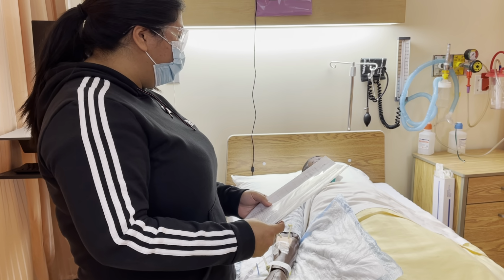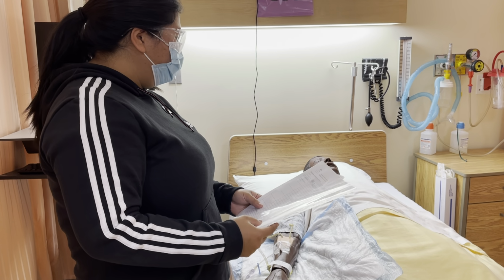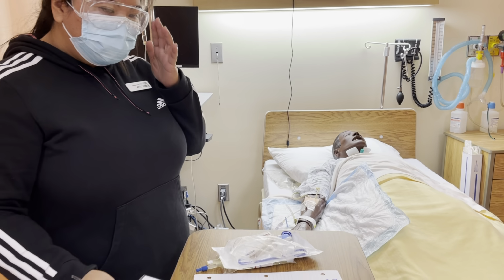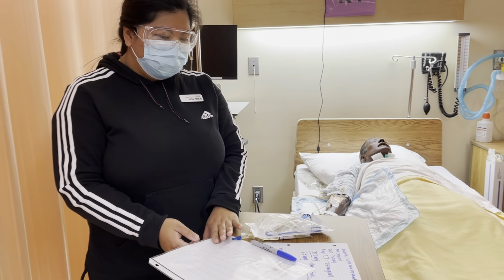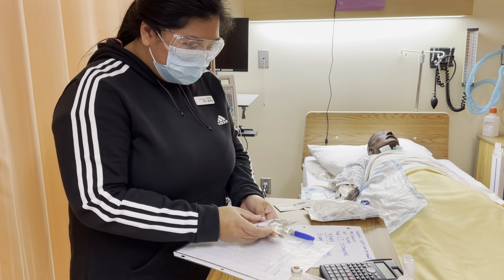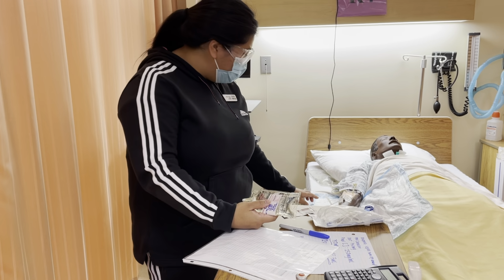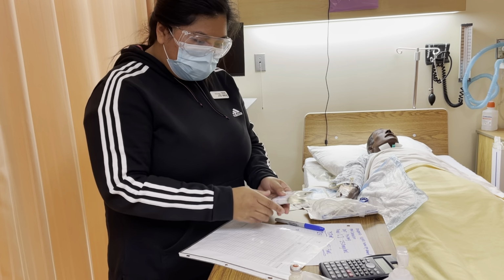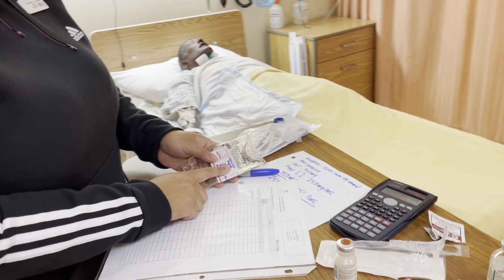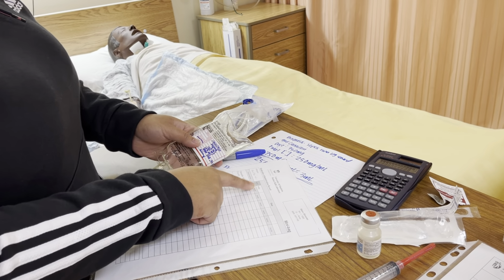And do you have any allergies? Are you allergic to morphine? Okay, that's what I have here too. So we'll also do our third and final check of the medication. So our patient, Shane Shredder, and then I have Cloxacillin, dose is 750 milligram. The route is IV and it is due now.